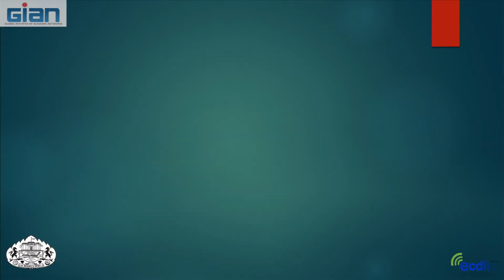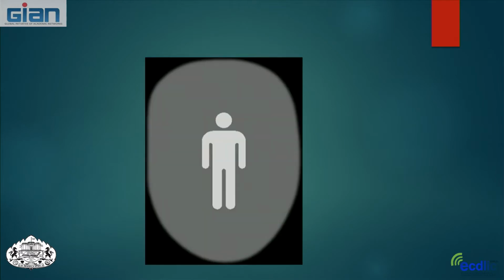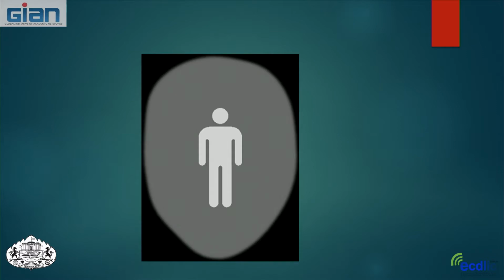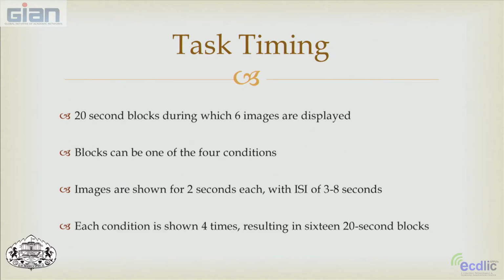Okay, and then the next block, they would see something like this. And that's about the right speed. I think I timed these to show every 2 seconds, which is what they see in the actual experiment. Again, the blocks are actually 19.5 seconds, during which 6 images are displayed. And again, these blocks can either be angry, fearful, neutral, or control.